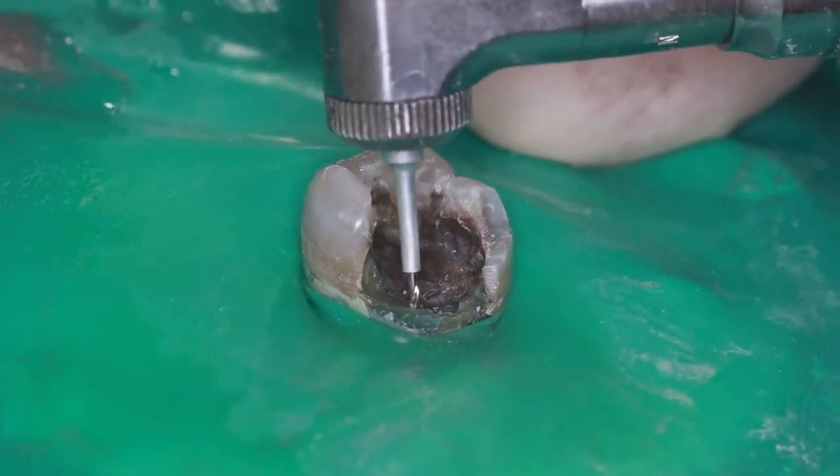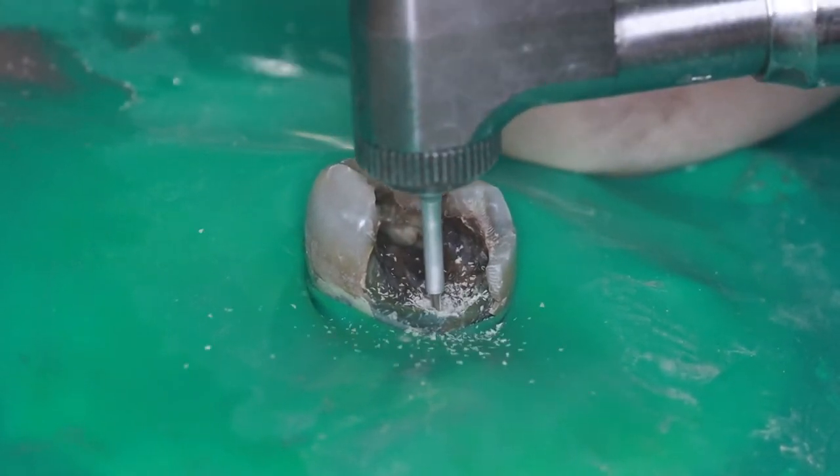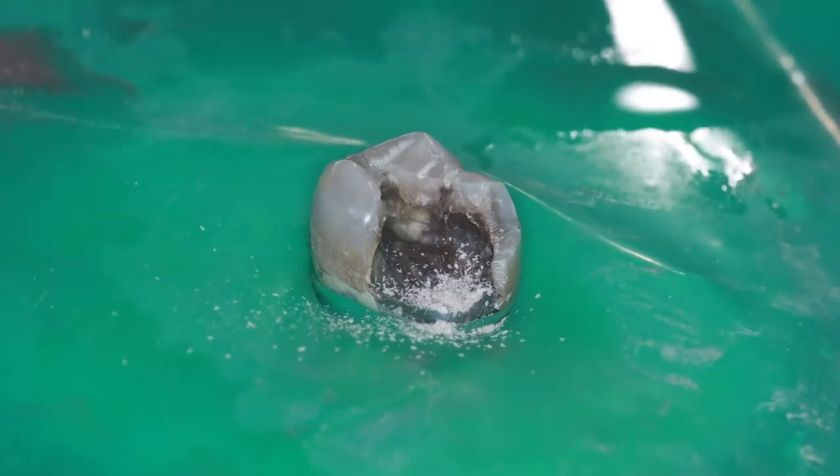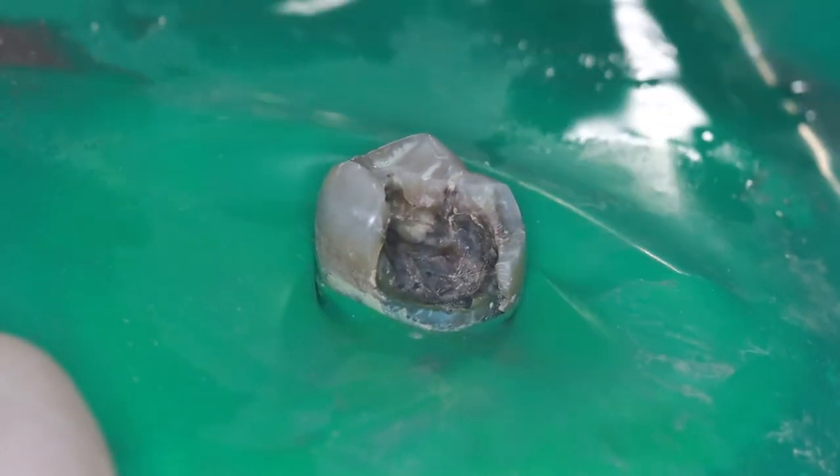I don't have to worry about going too deep because the drill has a built-in drill stop that prevents me from drilling too deep into the tooth. One thing I have to be careful of is to only run the drill once to drill the hole. I don't want to pump the drill up and down or wiggle it from side to side, because then the hole will be too big and the pin won't self-thread into it.